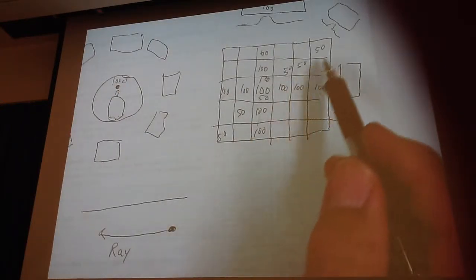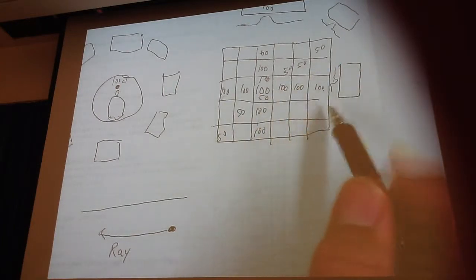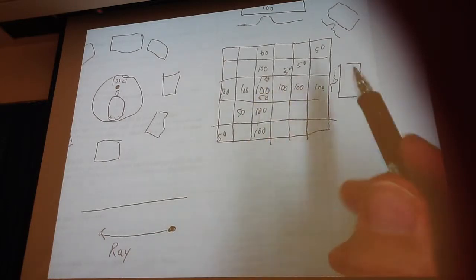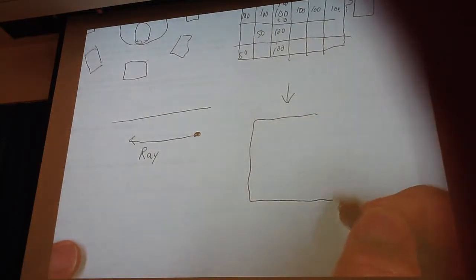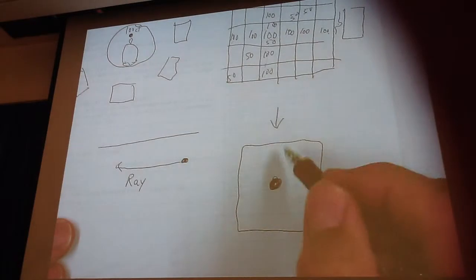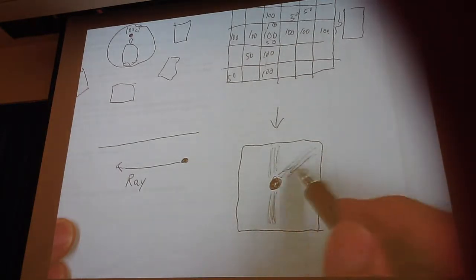Okay, so with back projection then, we have a situation where all of these projections intersect at the source of my radiation here. Now, if I just left the picture like that, it would look something like this. Here's my pixel that has all of the intersection points, but then I would have all of these lines coming off of it from all 64 projections that we made.